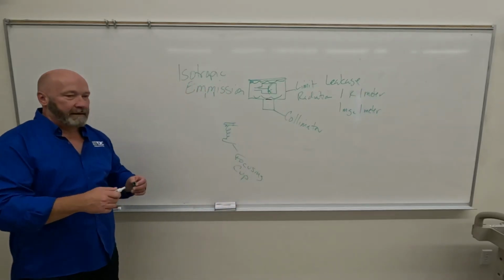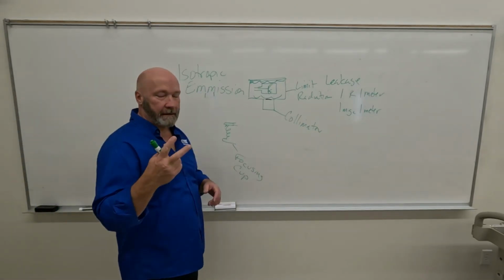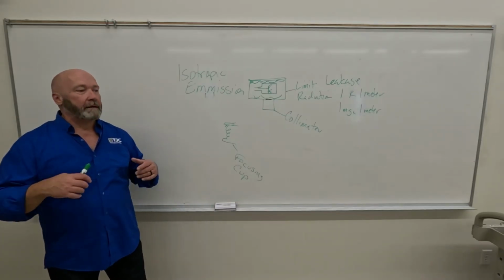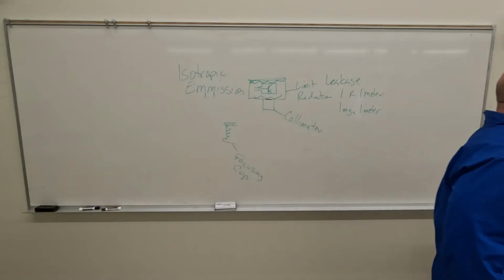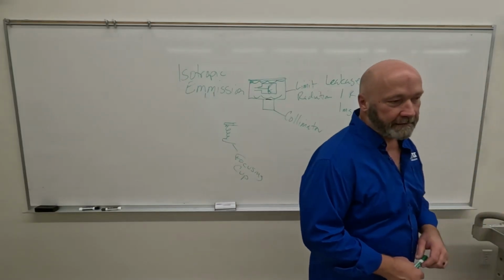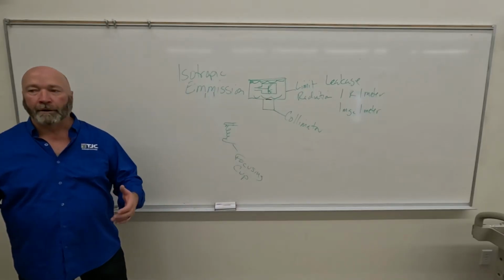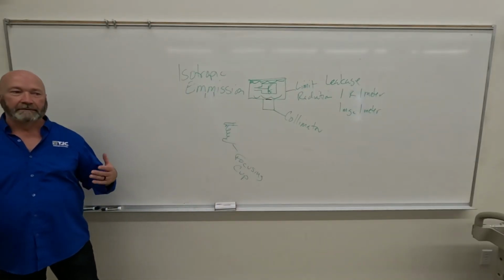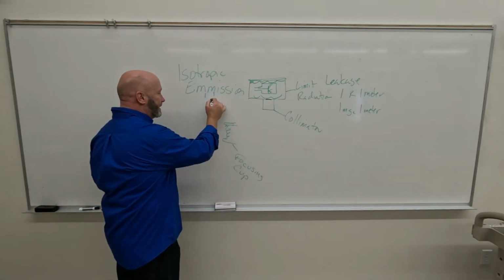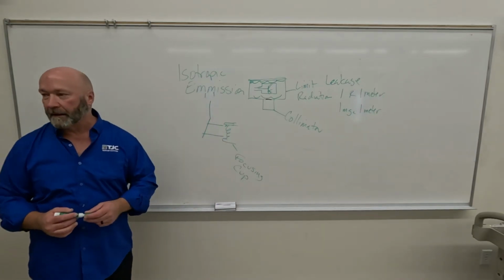All right, so the filament is embedded in a focusing cup, and what we have inside of that focusing cup is generally two filaments. One large filament, one small filament. Large filament for high exposures, and small filament for sharpness of recorded detail. And we'll talk about those here in a bit. So we've got the filament, we've got the focusing cup. The purpose for the focusing cup is to keep the stream of electrons compressed so that they travel across the X-ray tube and impact the part of the target that we want them to impact.